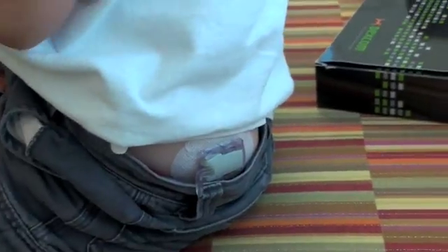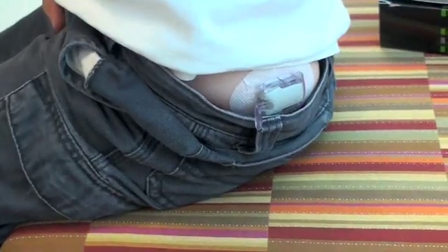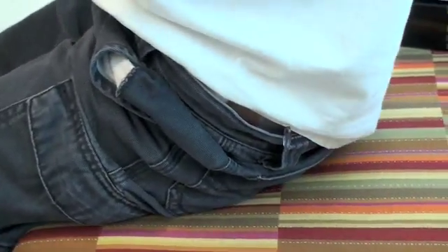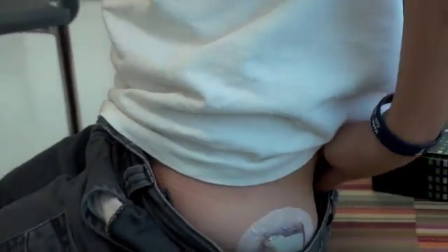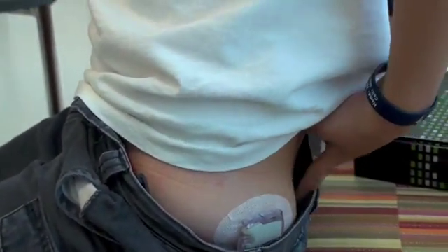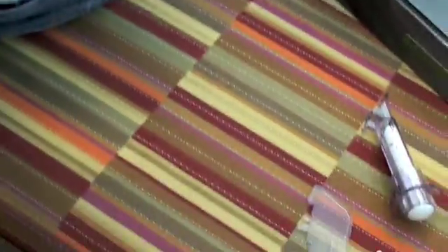You okay, buddy? Yeah, it didn't hurt. I can't believe it. Do you want me to turn it off yet? I'm so excited. Now I can have my DS. Does he get the DS? Yes, he does. Oh man, Caleb. You know why he gets it? He gets it because he was a good sport and he was willing to do it. It didn't hurt — are you shocked? I think you're in shock. Hey Caleb, when you're done with that disc top, I want to keep it and study it. That's okay. I want to keep those pieces too.